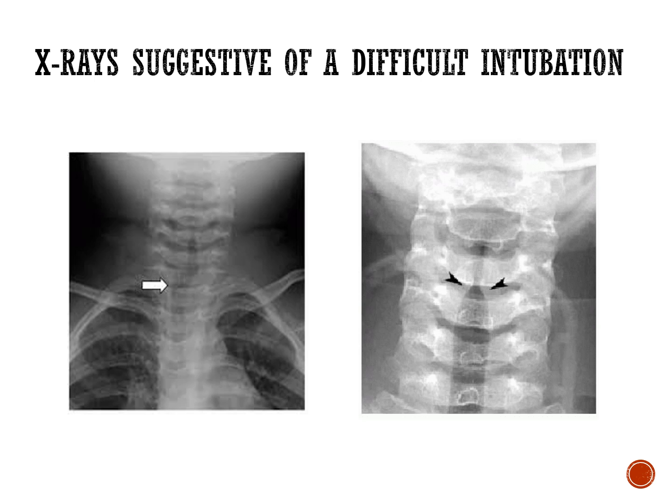It looks like there's a deviation where the actual trachea does kind of a dog leg right, if you will. Again, it's not common, not usual, but do understand that there are certain neck abnormalities that can occur with the vertebrae, that can occur with other bony structures that can result in this sort of a deviation.